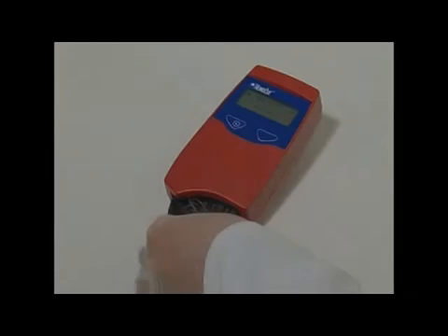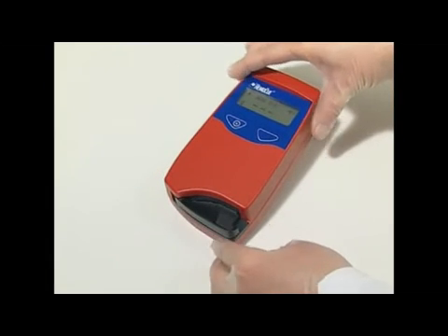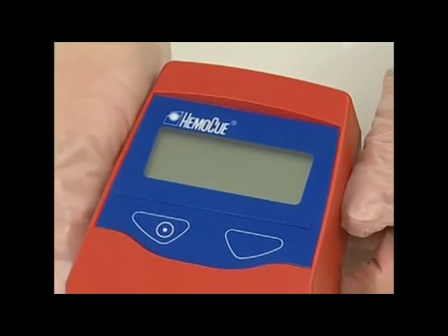The analyzer is designed to work for a long period of time without any direct service or maintenance. The analyzer should be cleaned according to the following procedure. Check that the analyzer is turned off — the display should be blank.